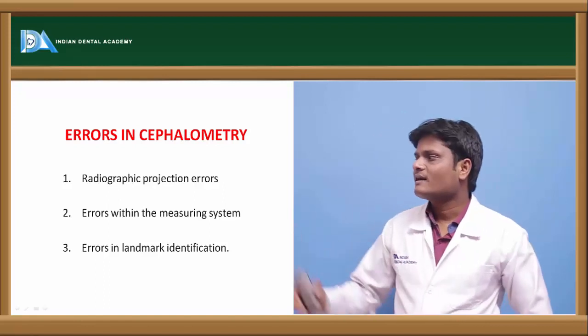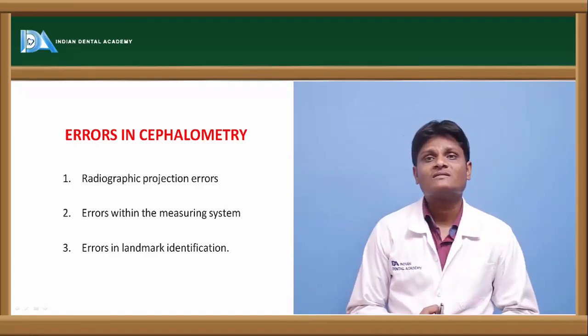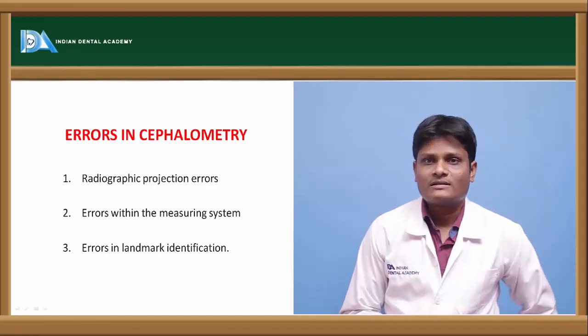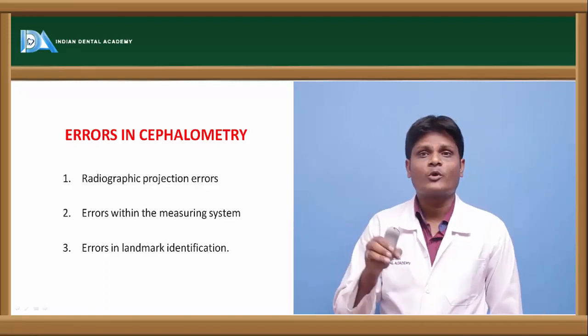So these are the errors in cephalometry and, briefly, how to overcome them. So this is about the lateral cephalometric analysis and the knowledge which you should have about this topic at this point of time.